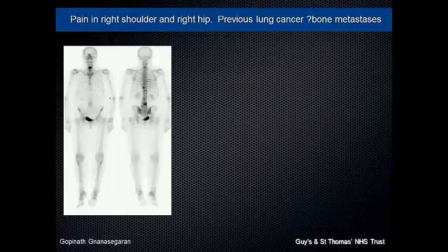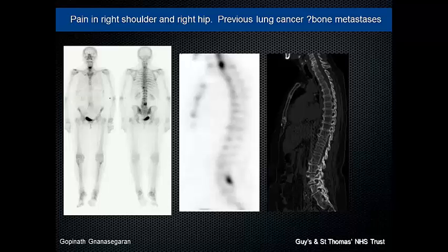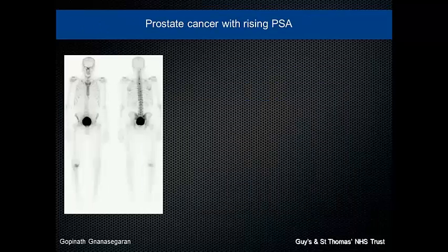Malignant or benign? This is a patient with lung cancer. There's uptake at L5. How many will go for malignancy? Good. How many will go for benign? Benign? I don't know. Good. In this case, if you had called benign, you would have won. If you had called malignant, you would have been in trouble, because that turned out to be just facet joint disease. So you made a definitive diagnosis by SPECT CT rather than saying it is suspicious. Radiological correlation, that's what I would have said if I had just a bone scan with me.